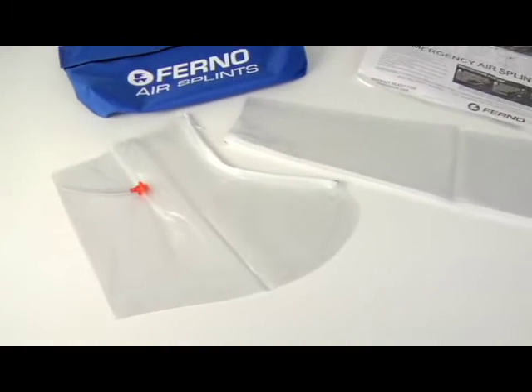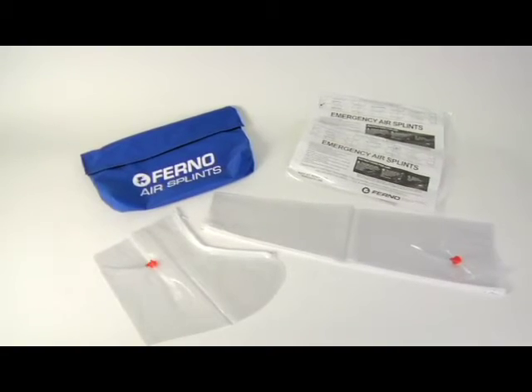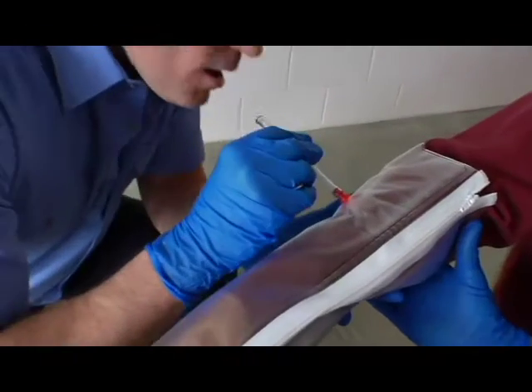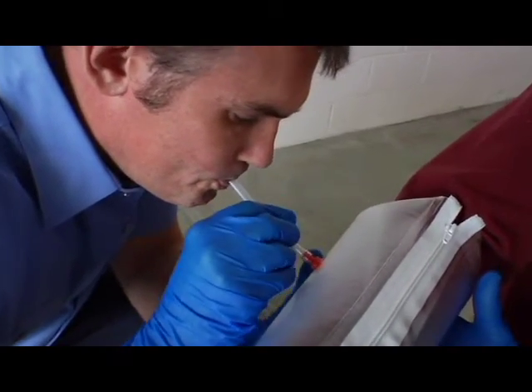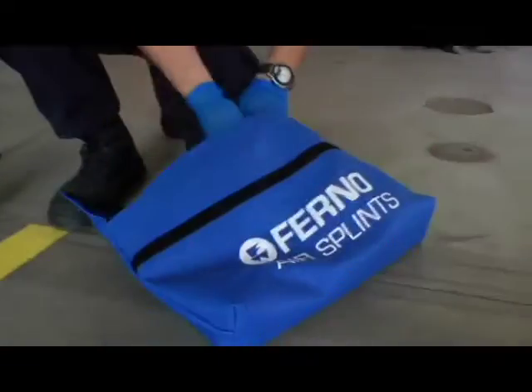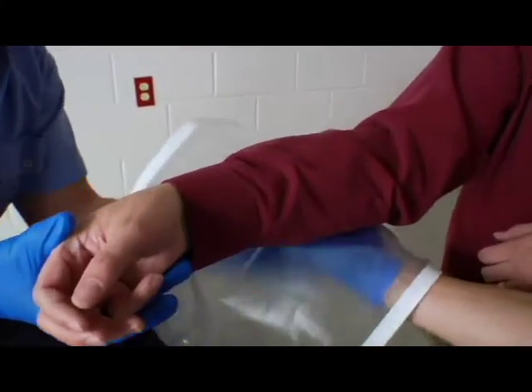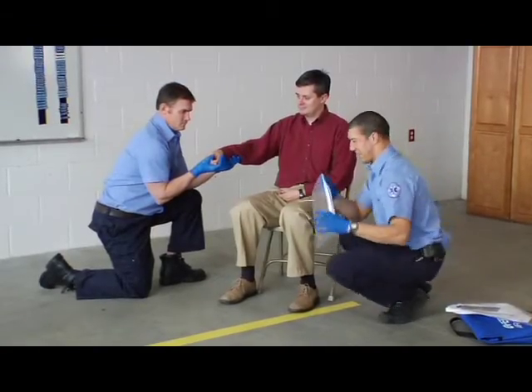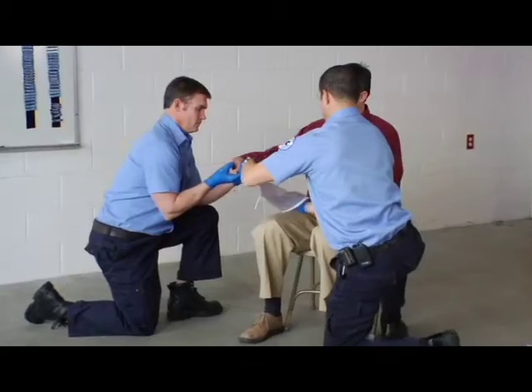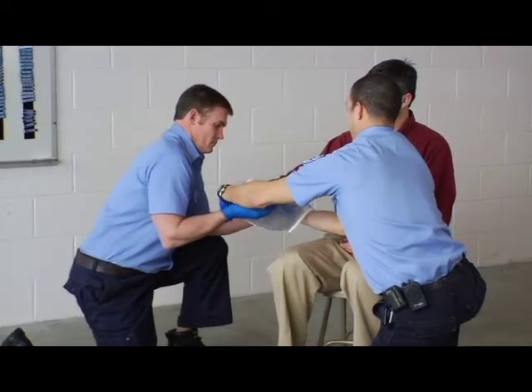FERNO air splints are inflatable splints designed to immobilize and support a patient's extremity when a fracture is suspected. Air splints are inflated using lung pressure and require the physical effort of one of the operators. Choose the splint size that best suits the injury. The splint should be large enough to extend beyond the joints on both sides of the injury. To apply a splint, one operator manually stabilizes the injured part of the body throughout the splinting procedure while the other operator applies the splint.